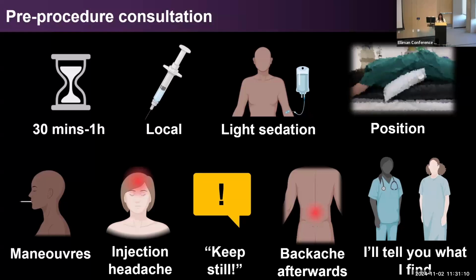to an hour, sometimes a little bit longer, depending on the type of myelogram I'm doing. We do this under local anesthetic, and we often give light sedation. We find lorazepam to be really useful because it's also protective against seizures. And then I'm going to tell them what position they're going to be lying in, which can be dependent on what kind of leak they have.